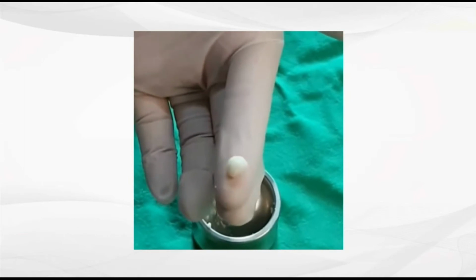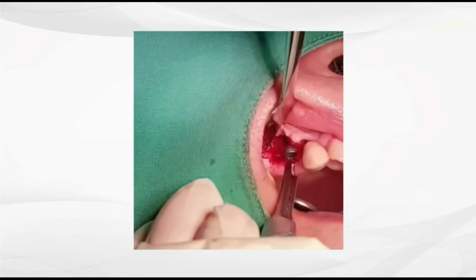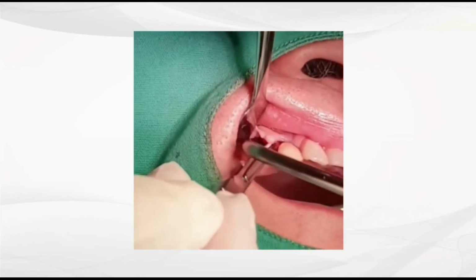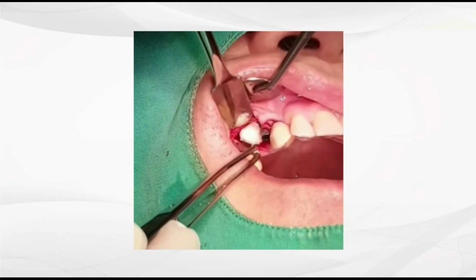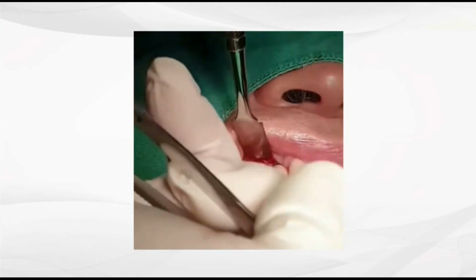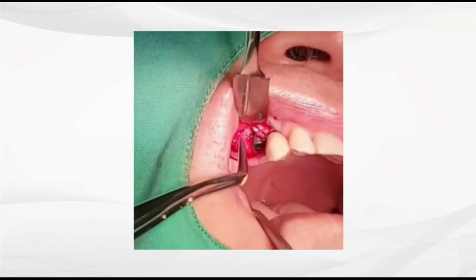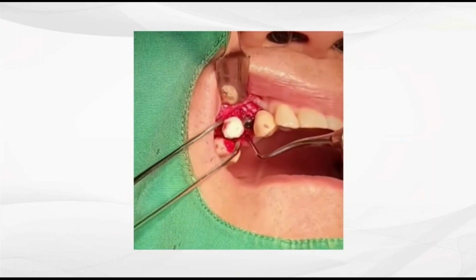for the grafting site. The circular shape of dentin is moved to the 1-5 GBR area, and as you see, it is viscous enough to be held and moved with tweezers. Press it lightly with an instrument or finger to adapt it to the defect. Next, move the second Moldable around the 1-4 implant and fill up the spaces.